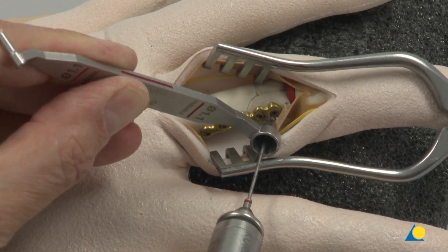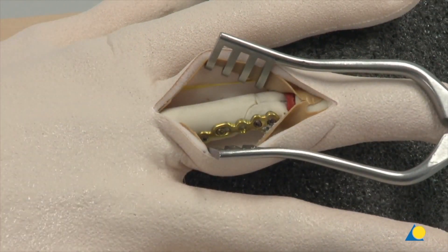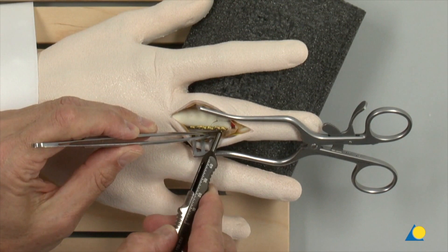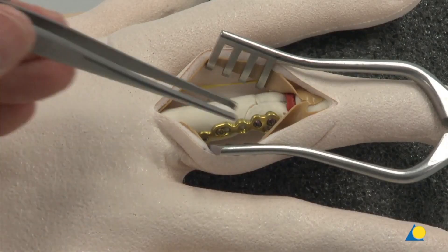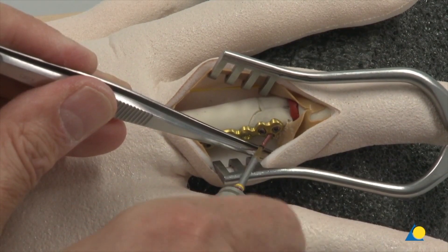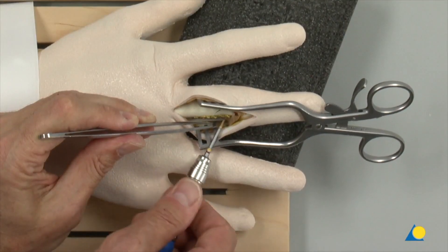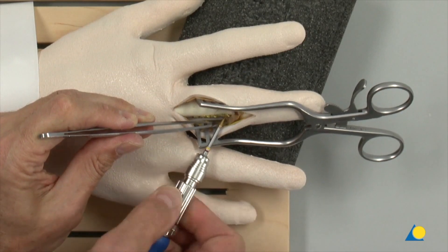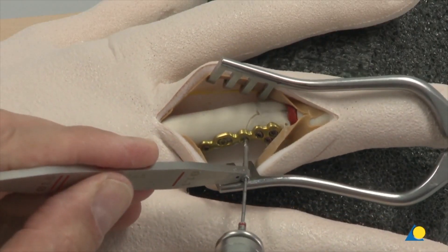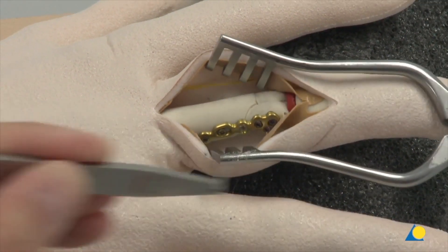A third screw will be inserted through the free plate head hole. The hole is drilled using the 1.1 variable angle double drill guide and 1.1 mm drill bit, and the depth is measured. The screws in the head fragments of the proximal phalanx should not protrude beyond the opposite cortex. Interference between the screws and the collateral ligament must be avoided; it is recommended to choose shorter screws. Additional screws can be inserted to fix the plate to the shaft fragment, as cortex screws or locking screws, depending on the fracture pattern.